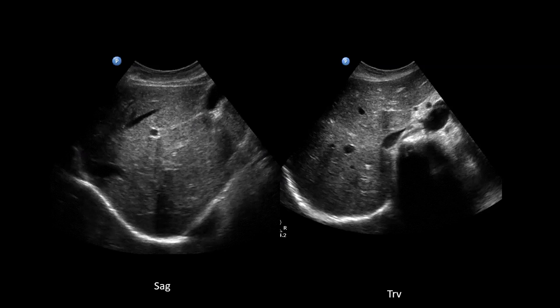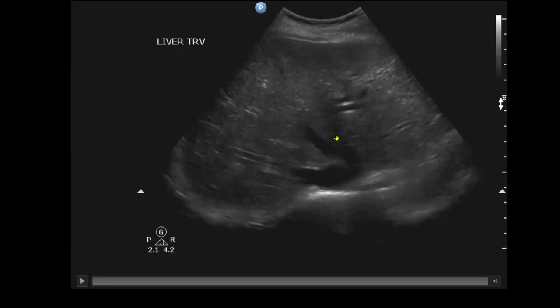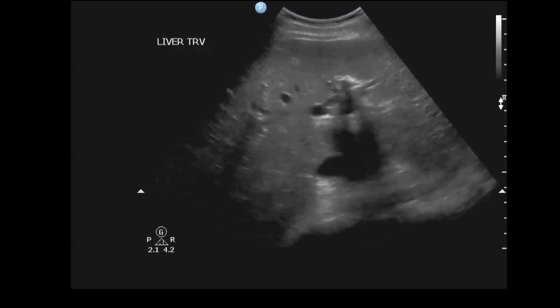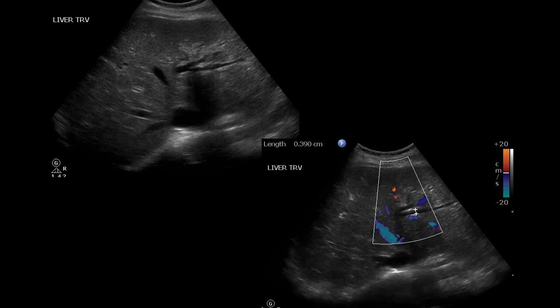The liver normally has a nice homogeneous appearance with portal triads coursing through it. In contrast, a pathological liver might show a lot of tubes — way more than you should see — aligned in patterns consistent with the portal triad. To distinguish ducts from vessels, you apply color Doppler: ducts show no flow, while you can see flow in the adjacent portal vein. This confirms intrahepatic duct dilatation.